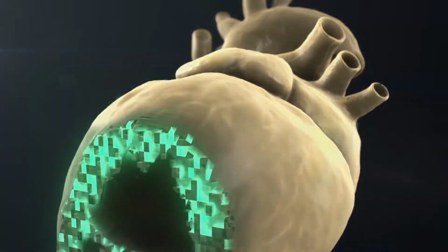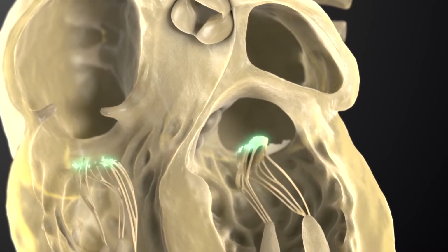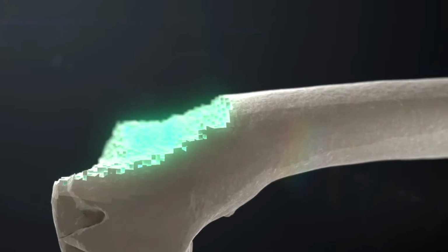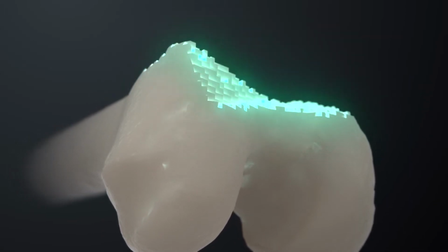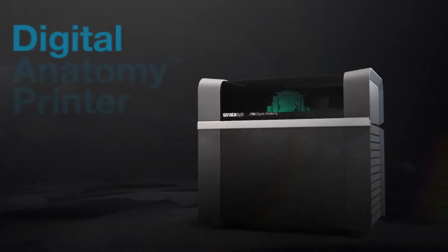The human body is a marvelous creation. Every person's anatomy is unique to them. That's why understanding patient-specific anatomy with biomechanical precision is essential for healthcare professionals across the globe. Welcome to Lifelike Digital Anatomy Printing by Stratasys.